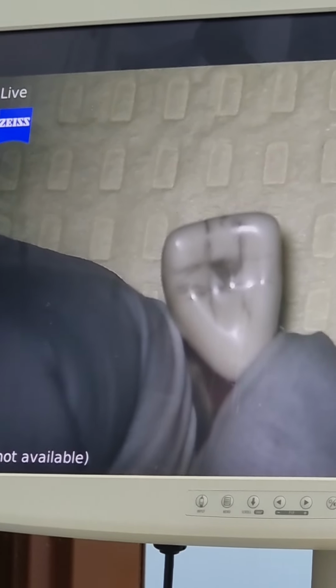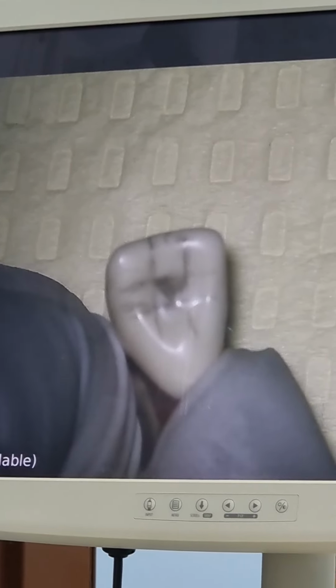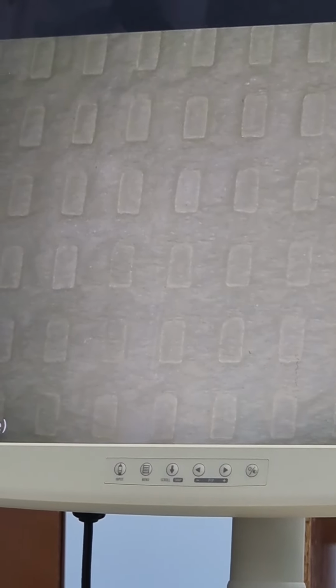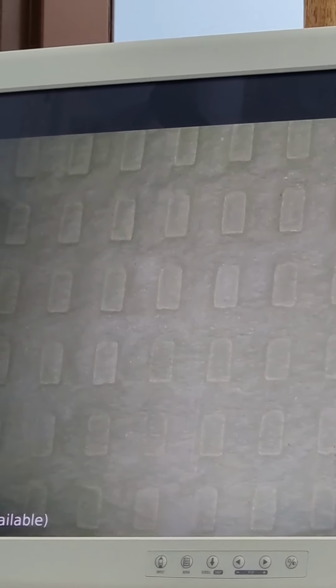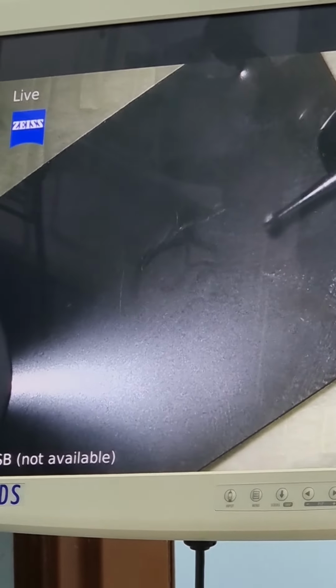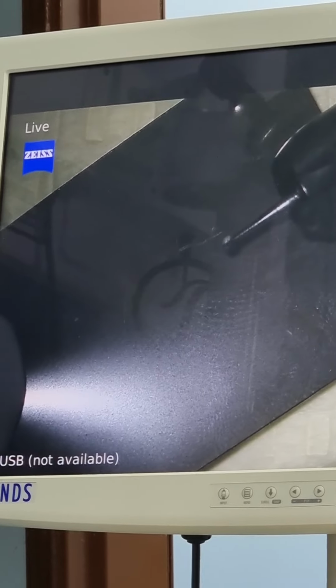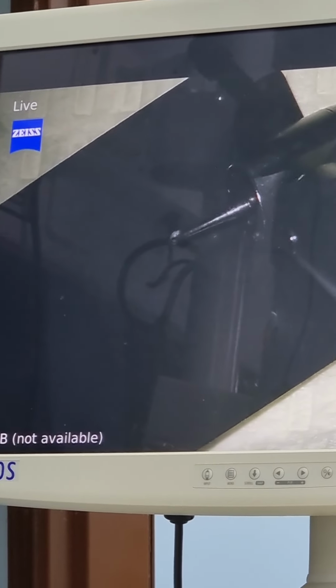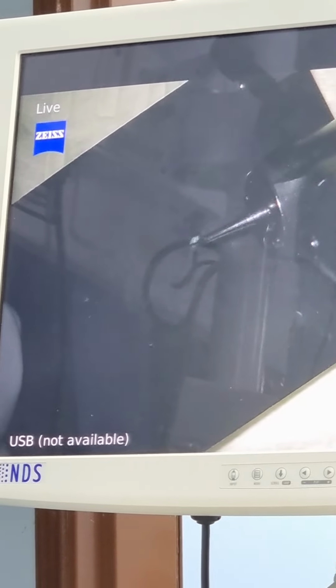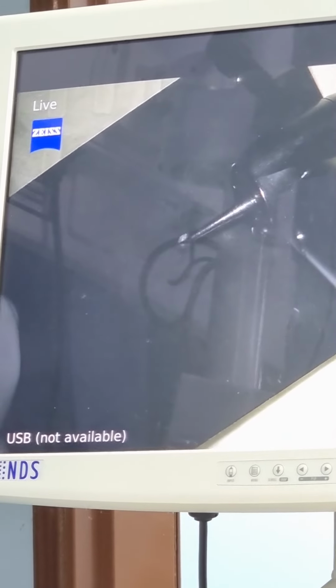So the first thing is, now you have the tooth. Before you start with the procedure, you have the X-ray. Take your X-ray, any one developed X-ray. You can't see the tooth here because you have to see it against the light. I'm just showing you: you keep the bur on the X-ray film in such a way that the tip of the bur just enters the pulp chamber roof, and then you see the distance on the shank.